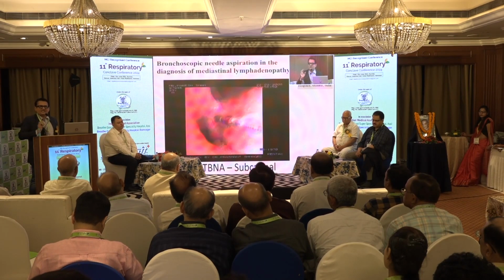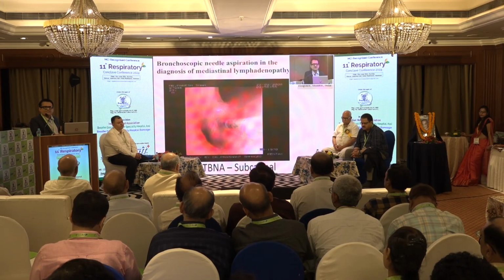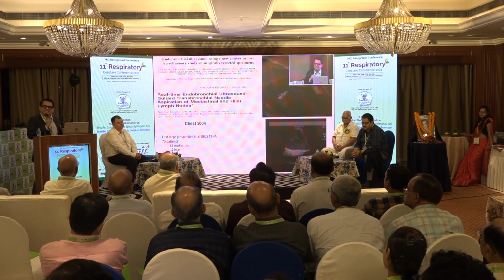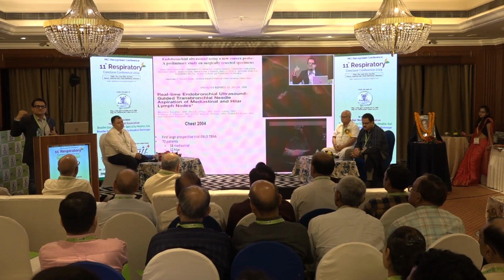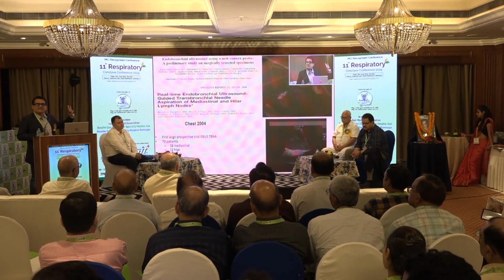Okay. Now again, I've shown you this. In this particular case, yes, we could make a diagnosis. Now again, things have matured. You were shown about EBUS. When the needle was put in the earlier case, you could not see where the needle was going. Now we do CT guided procedures, we do ultrasound guided procedures. So this is a bronchoscopic ultrasound guided procedure.